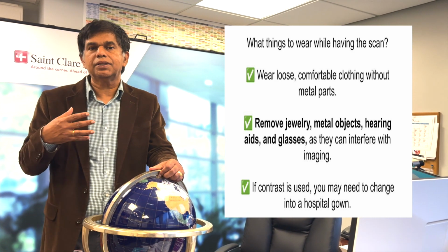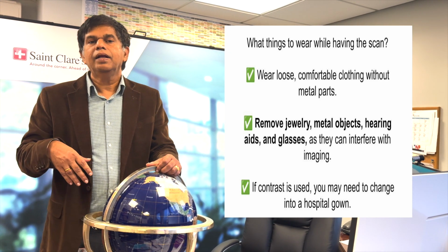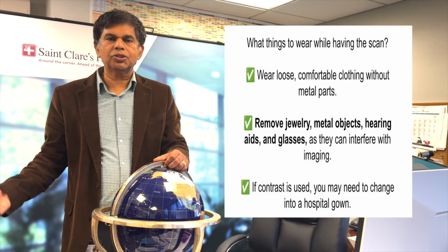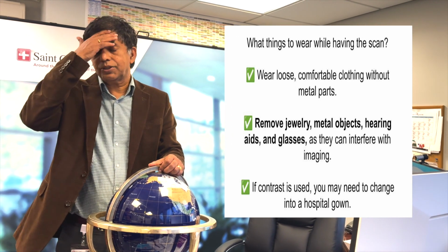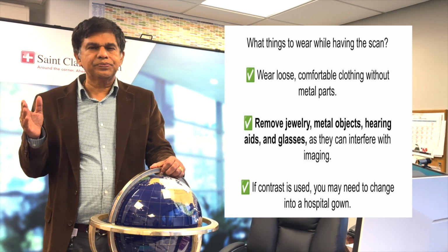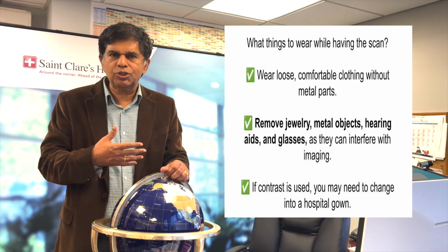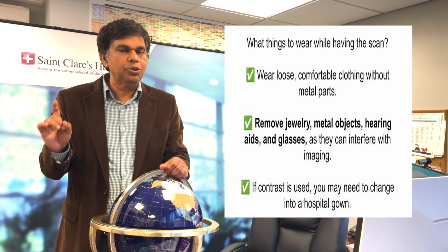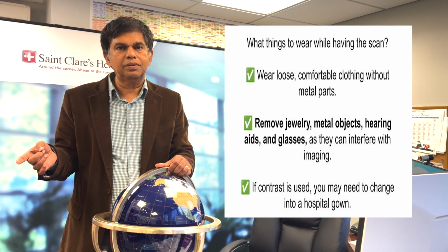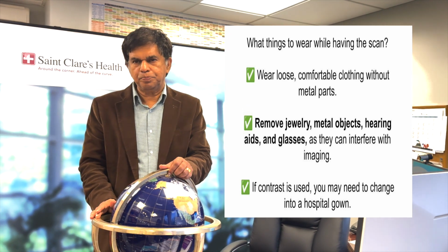Some of the implants in the body, right? Anywhere in the body. Sometimes they do an x-ray to find out if there is any, because a lot of people don't remember what happened, you might have had a fracture, what they did and all that. Sometimes they do this x-ray to find out what's going on. So you need to make sure you don't have anything in your body. Like a pacemaker is the main thing. Some of the new pacemakers, if you are getting a pacemaker, tell them it's MRI compatible, okay? Otherwise you won't be able to do it. That's a big problem, okay?